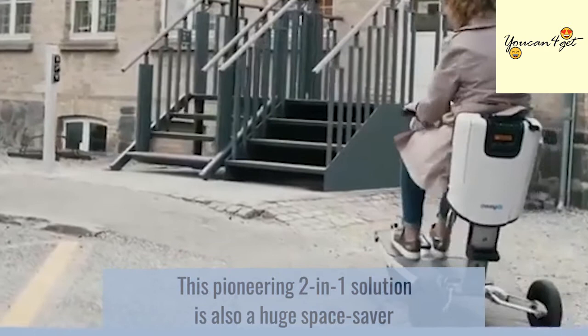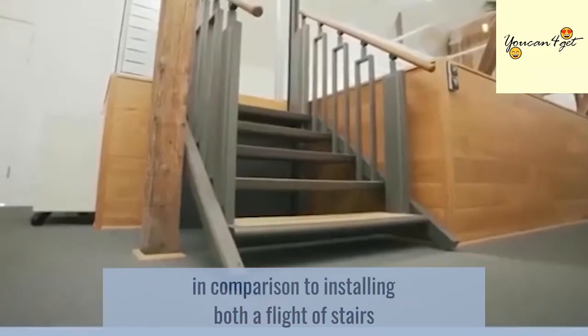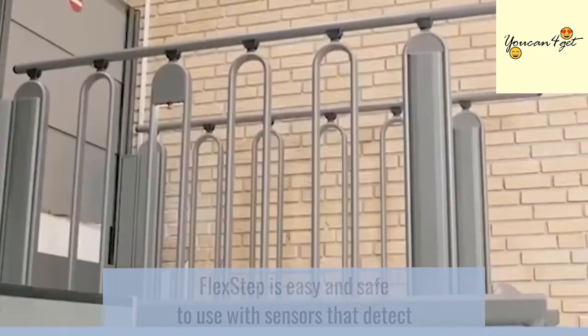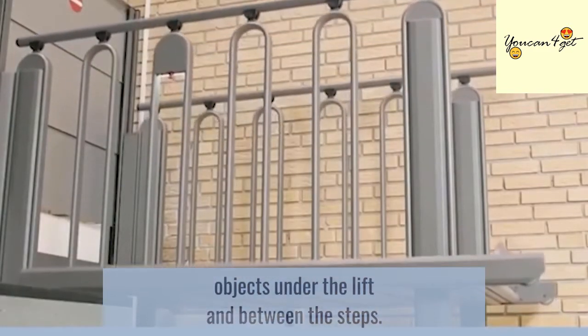This pioneering two-in-one solution is also a huge space saver in comparison to installing both a flight of stairs and a separate lift. FlexStep is easy to use with sensors that detect objects under the lift and between the steps.